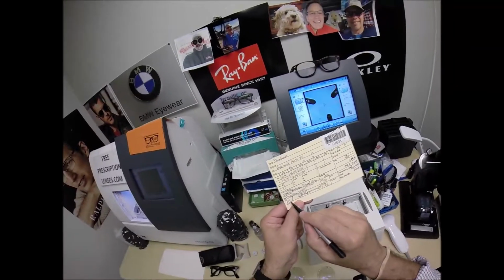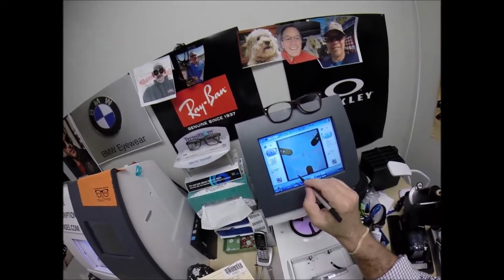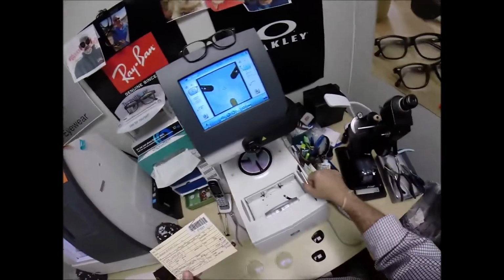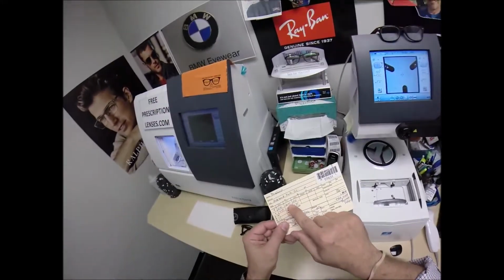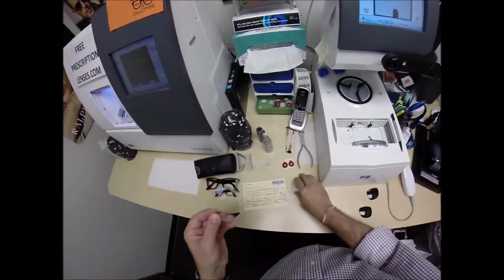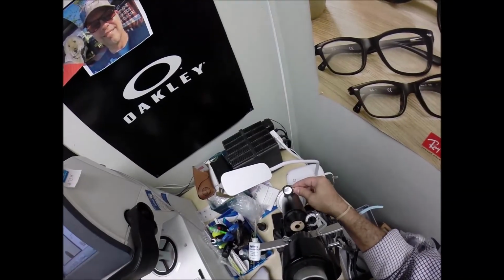So your pupillary distance is 32, the computer starts at 32.5, so I just have to tap that minus button one time to bring it there. I want to raise the optical center up to 23. Let me write that on there. 23. Now your right eye reads minus 2.75, minus 2 at 10. It comes from the lab with an R on there. So let's just see if this is your right lens. I'm going to spin the axis wheel to 10.